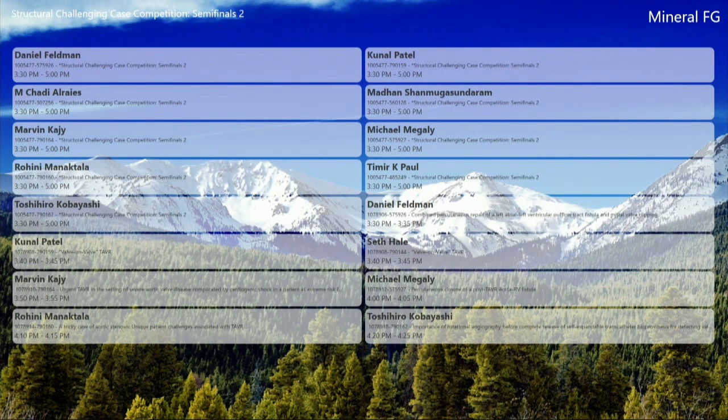Did you send it back to the vendor to see if this is a defect in the valve itself? Yeah, did you mention this to Medtronic? We had it happen twice during my structural year. Same thing during recapture. I guess if it hits something and there's pressure on it, it'll just invaginate as you recapture. Medtronic was present for both of them, and they said you can technically still redeploy it and just post-dilate it, and it'll actually take care of it.